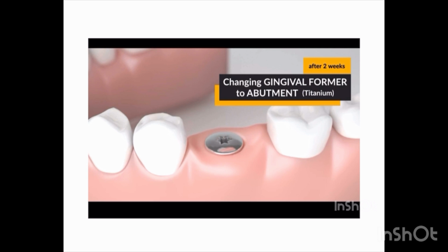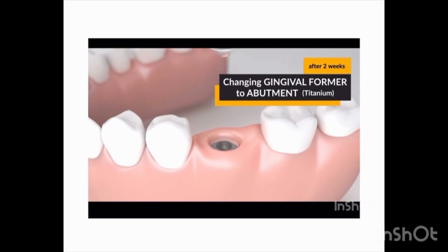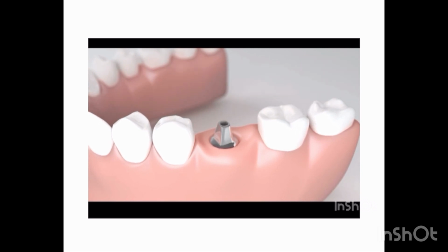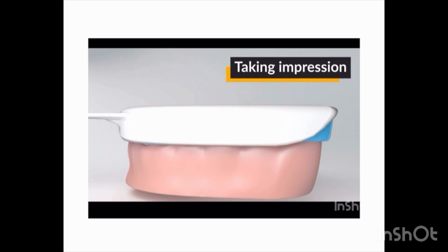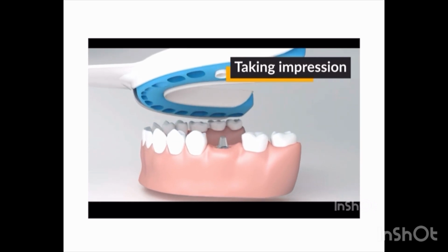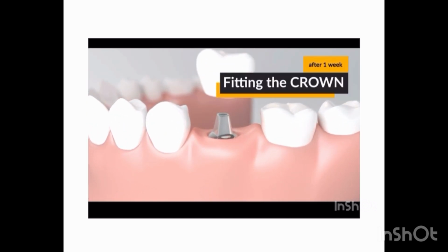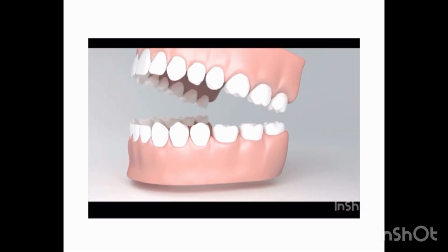Two weeks healing period of the gingiva. Then the impression is being taken. Crown preparation and fitting after trials. And then the implanted tooth is ready.